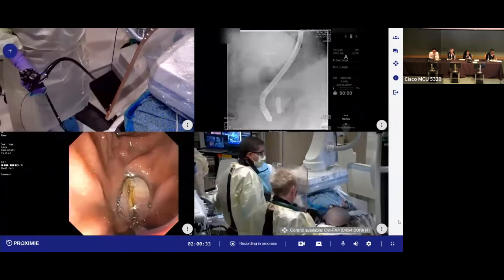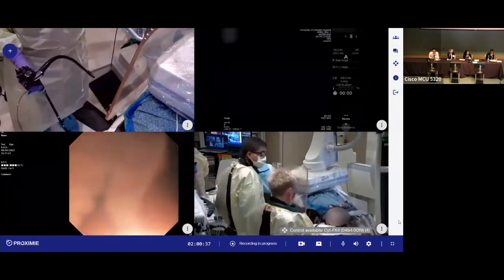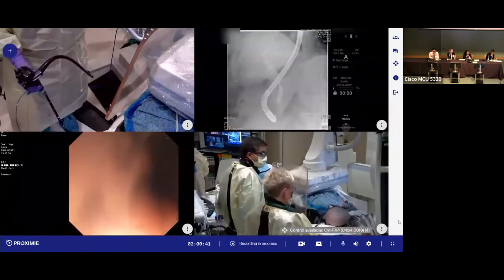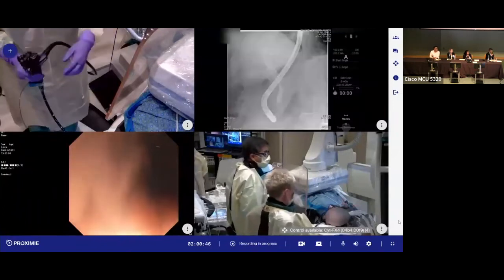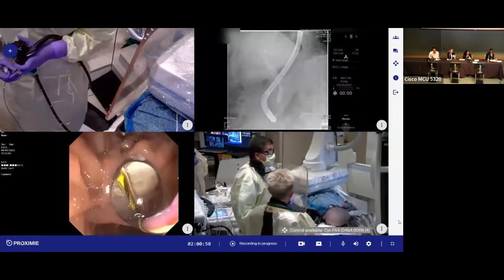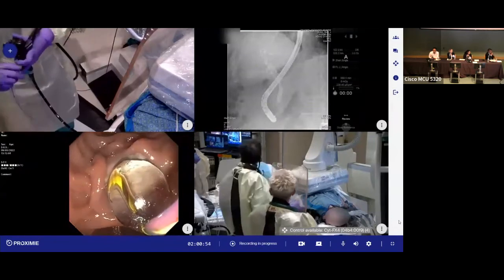So I'm going to go to a reference image, and now I'm going to scroll. Let's see. Yeah, there you go. Oh, that's the last one. Okay. So I want to see, you can't see the reference image that I have, but I think that's about the size of the balloon that I currently have at the lower duct. Yes.